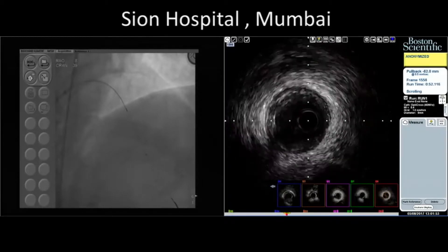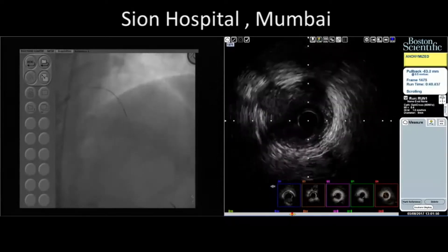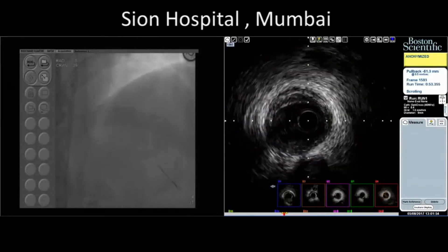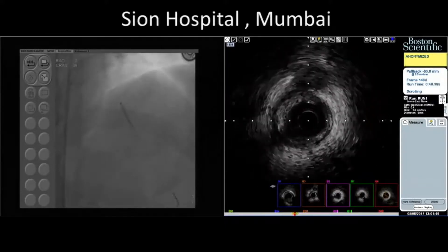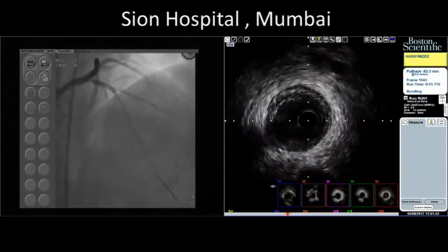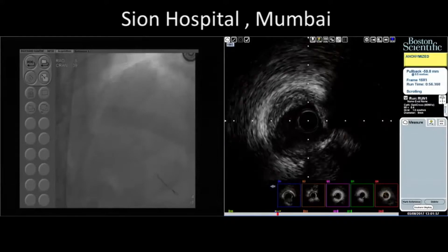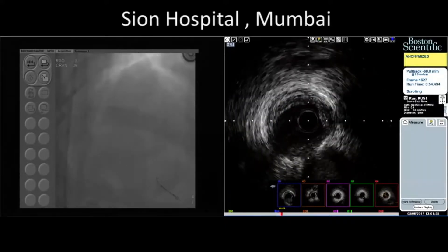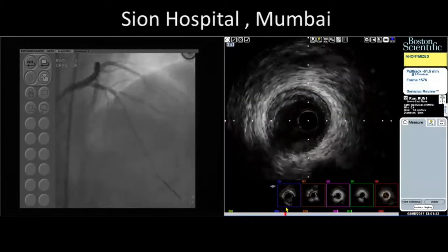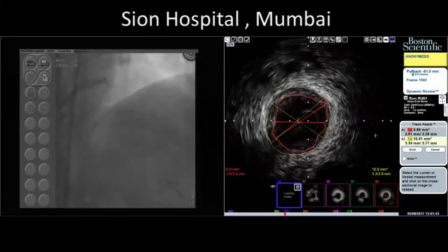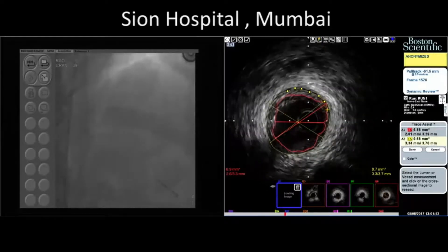Could we use a smaller one? Show the last picture — shorter length. We'll place this after the diagonal. If we need anything proximally, we'll use a bigger one. We have 3.5 also. So this is — take out the sheath and the wire — minimum touch, no-touch technique.